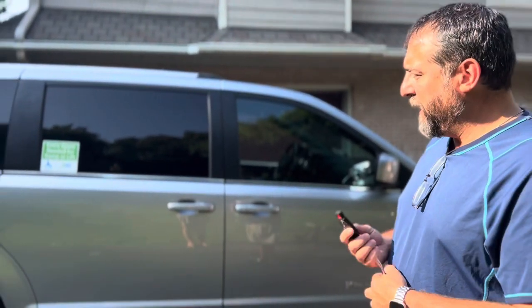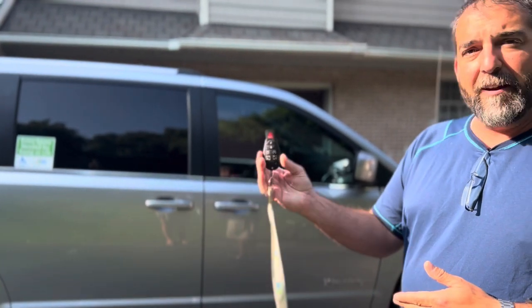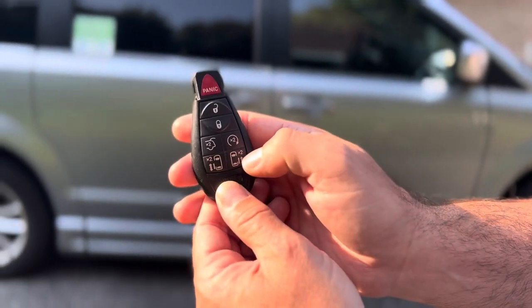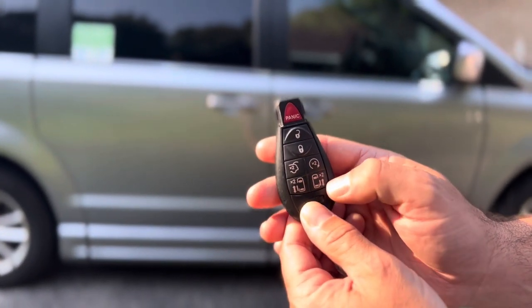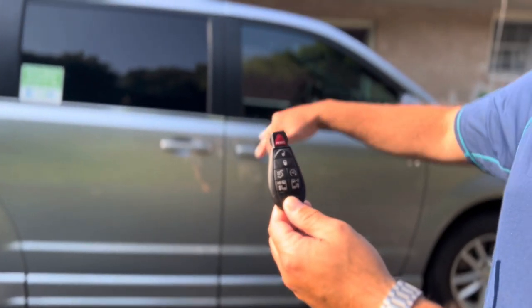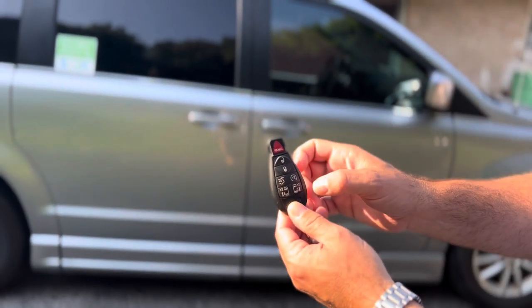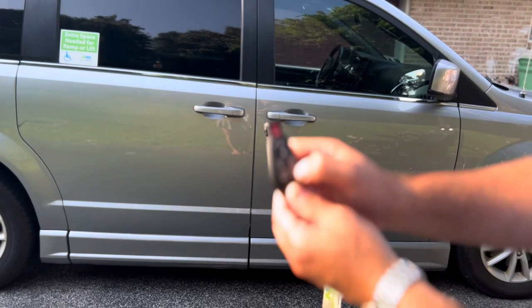This van has a wheelchair ramp that comes down and you can operate it from the remote. On the remote, the two bottom buttons have a door icon times two, which means you press it twice. The ramp is on the passenger side, and to operate the ramp and that door on the remote, you press the right-hand side button twice.